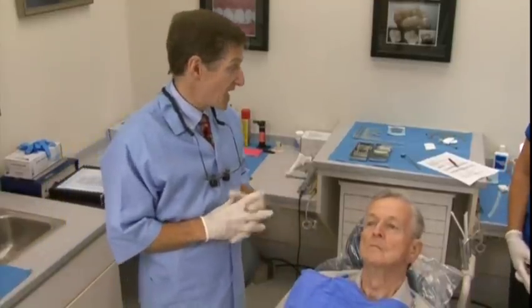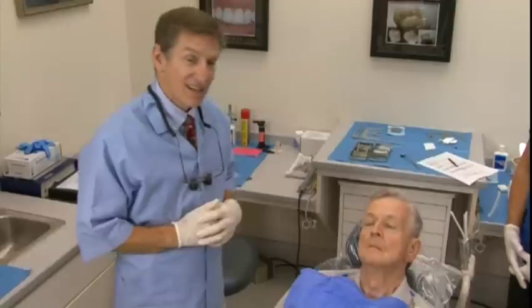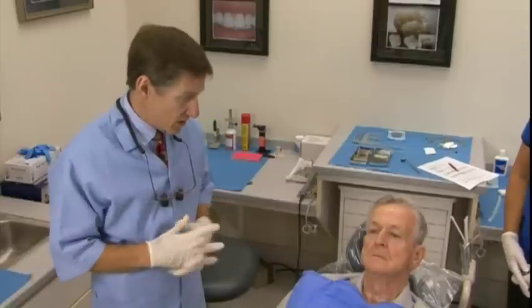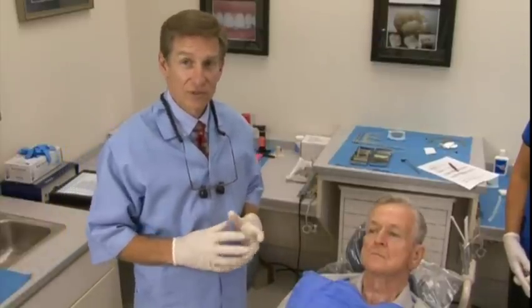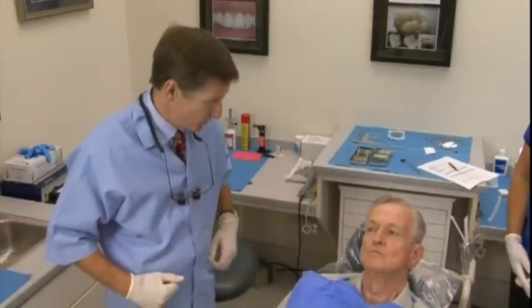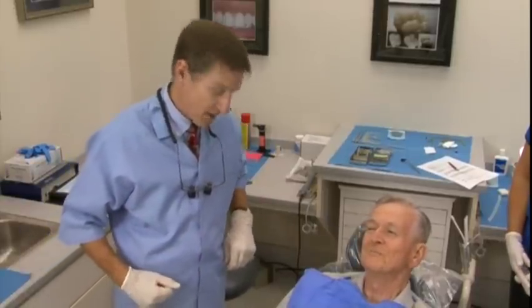One of the things that Kathy and I have found over the years is the AccuDent or AccuGel impression procedure for denture patients and partial patients is just excellent. I held off using it for many years, thinking I was good enough with the trays I'd always used — change is hard. But my friend Tom McDonald convinced me to try it, and it really gives a much better impression.